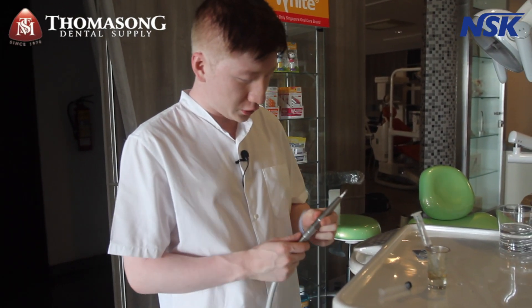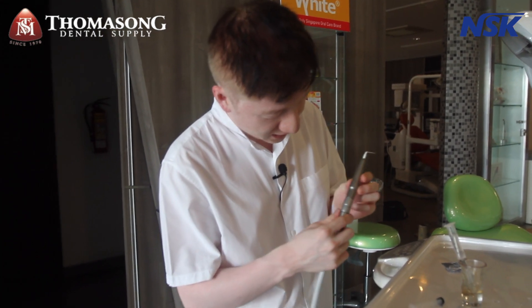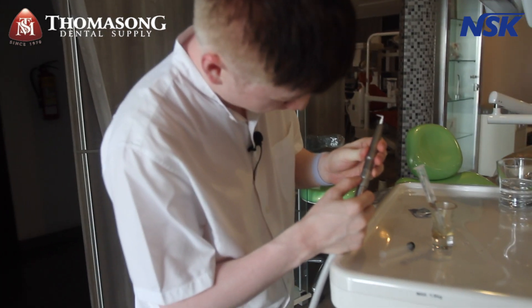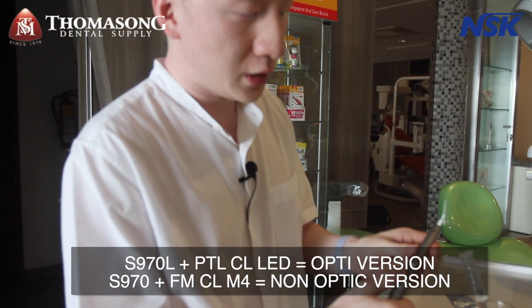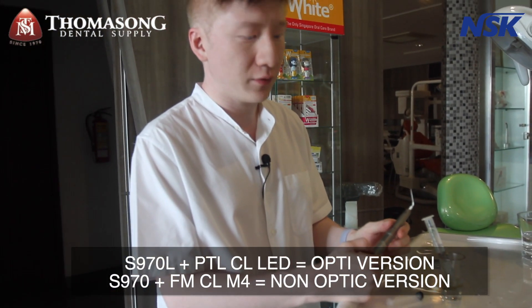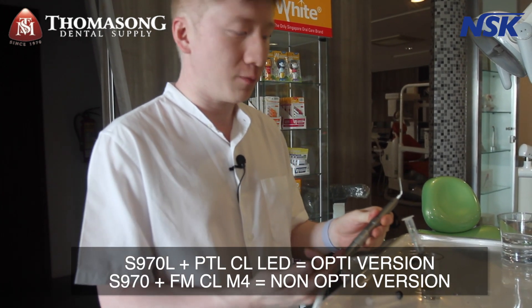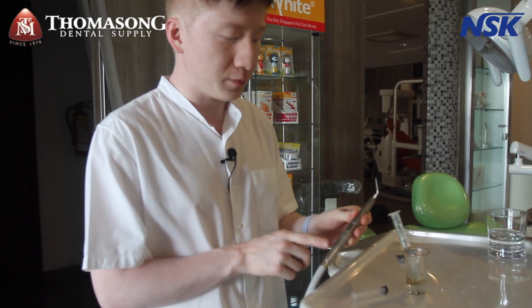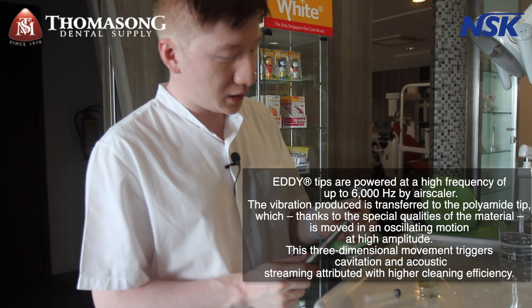Good morning doctor. Today we would like to introduce the Eddy tips and the Airscaler from NSK. I am using the S970 variant — that's the non-optic version. There's one more that comes with optics, the S970L, but you need a different optic coupling for that. Here I'm using the non-optic coupling and the non-optic handpiece.